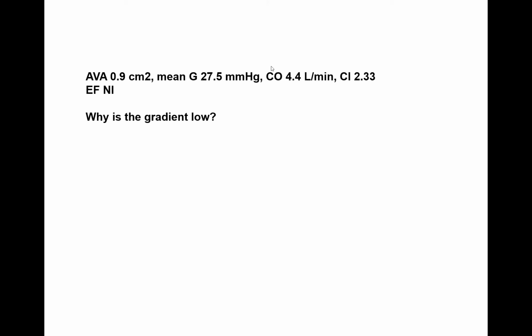Can anybody tell me, is it severe or not? Severe based on the valve area. Okay. Well, how about the gradient? Why is the gradient low? I wonder if it's like a low flow situation. Even the cardiac output is low, but the index is 2.3, so it could be a low flow, low gradient situation. Could be low flow, low gradient, except the flow is not that low.